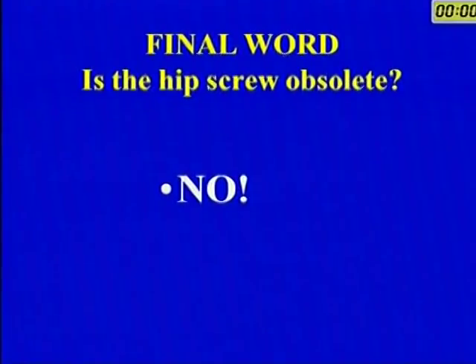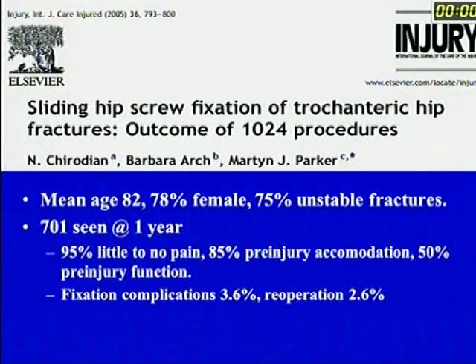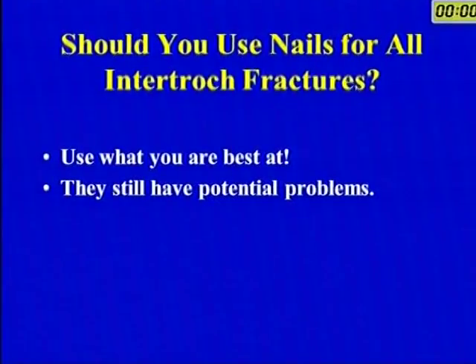But is the hip screw or dynamic hip screw a bad implant to use? Absolutely not. Even a paper as late as 2005, with a fairly large number of unstable fractures, 75% unstable fractures, with a follow-up of 1 year, has shown only a 3.6% rate of complication and a 2.6% rate of reoperation. So the sliding hip screw is definitely not out. Use what you are best at, but for certain fractures, it may not be a bad idea to develop experience with an intramedullary device.